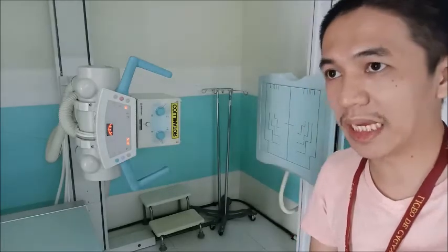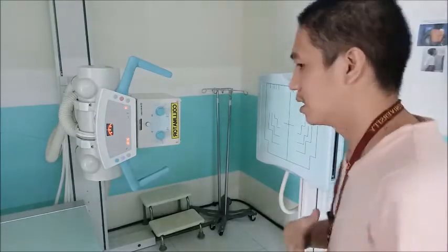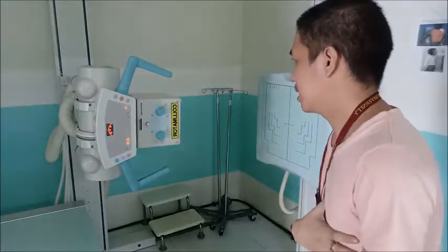No, do not let the patient breathe in deeply. Okay, that would result in more injuries to the patient. And if the trauma is a vehicular accident, or the patient was punched, and our target is the ribs, that is a different type of examination, not chest PA.